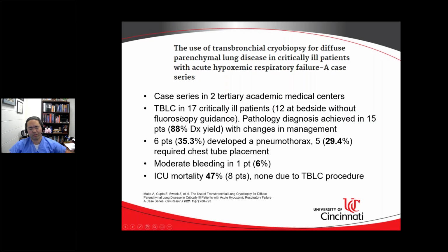And again, because it's a small number case series, the numbers look bigger than what they are. Or it's probably, if we would have just done 100 patients, we would have seen this as well. Moderate bleeding was only observed in 1 patient or 6%. And the ICU mortality was really high, but none due to transbronchial lung cryobiopsy procedures.